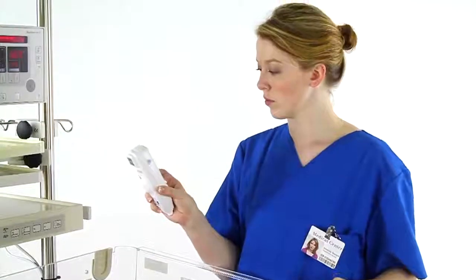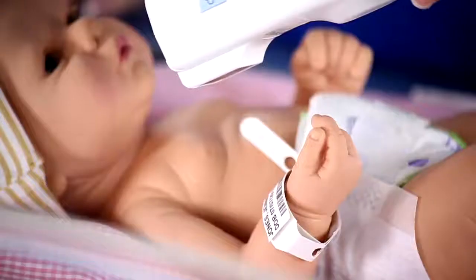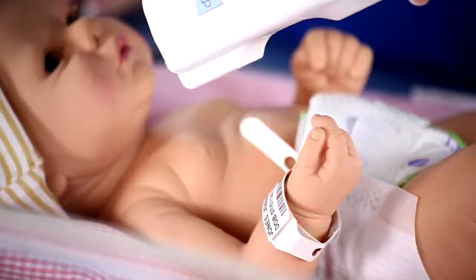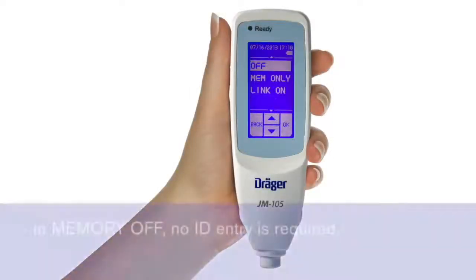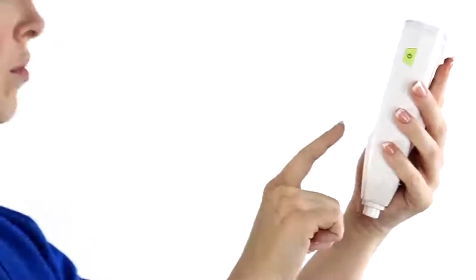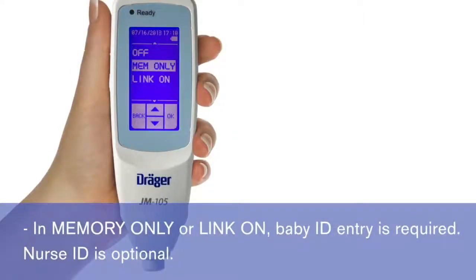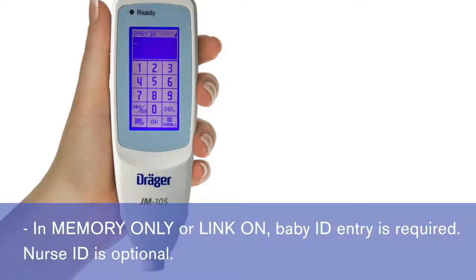The next configuration is the preferred method of entering a nurse ID and/or baby ID when a measurement is taken. If you have configured the JM105 with memory off, it will not be necessary to enter a nurse ID or a baby ID because the jaundice measurements are not stored. However, if you have configured the JM105 to store and transfer measurements with memory only or link on, a baby ID will be required. Entering a nurse ID is optional.